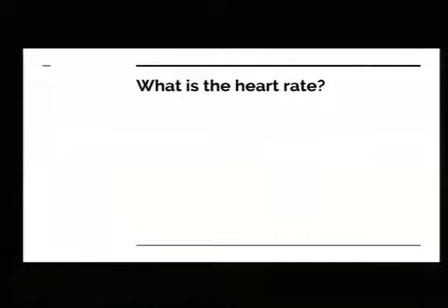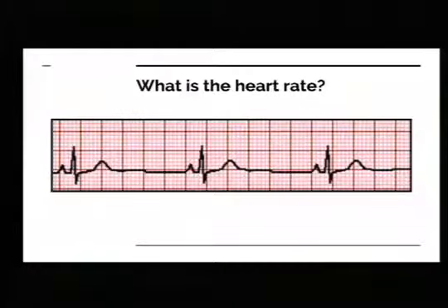So what's your heart rate here? Don't cheat and look at your handouts. So 1, 2, 3, 4, 5, 6.